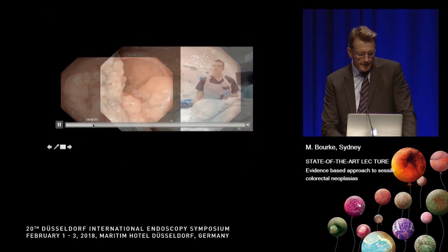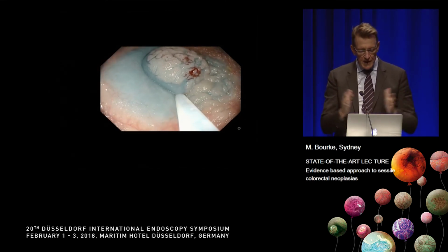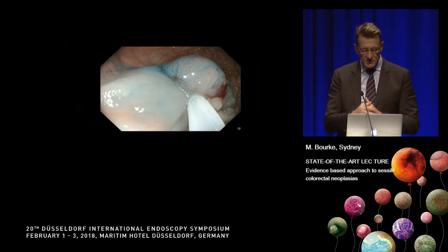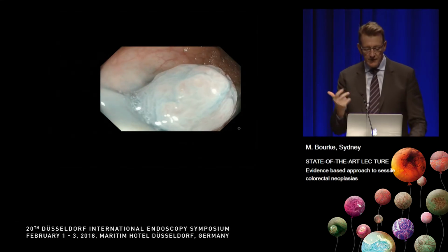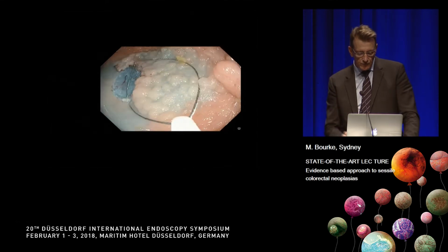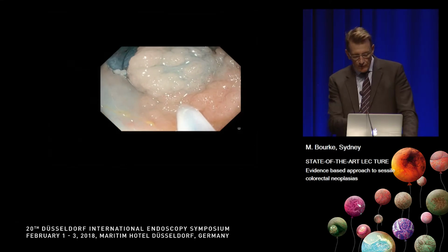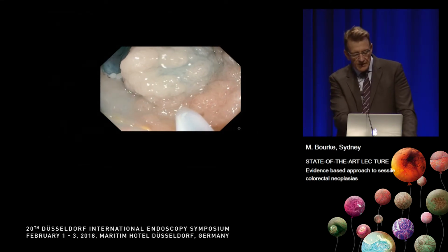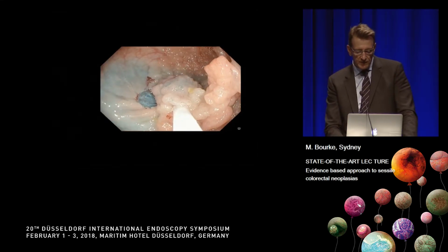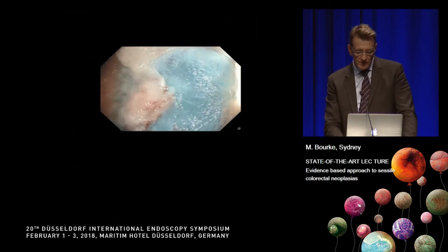And so here we start with the injection, and then include a margin of normal tissue, aspirate gas so the footprint of the lesion is reduced, close the snare, use a staged snare closure so you don't just close quickly but close a little and then completely, and then we check mobility, cut through, and we can proceed very quickly to remove this lesion. You need to align the snare with the edge of the mucosal defect. Here we haven't included a margin of normal tissue, so maybe we leave a microdot of adenoma at the end, and I'll come to that as to why that might be the reason for recurrence. Because within the defect, I think if you operate in this way, you don't leave residual tissue within the defect.